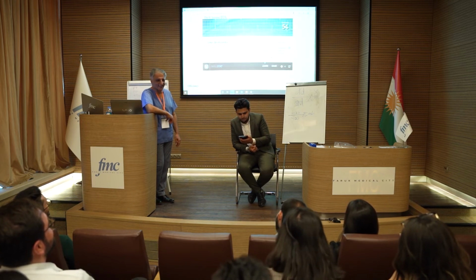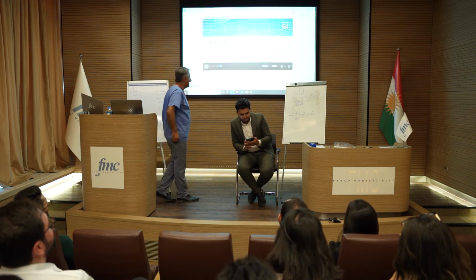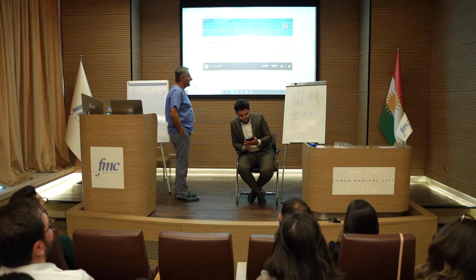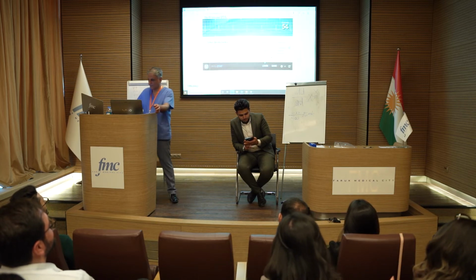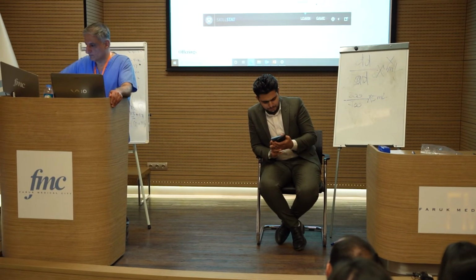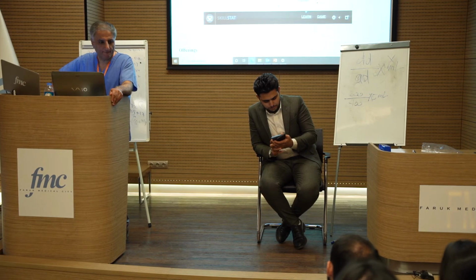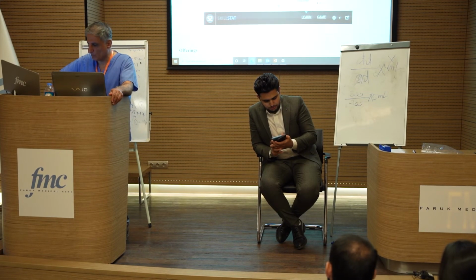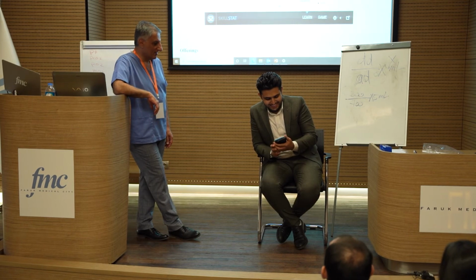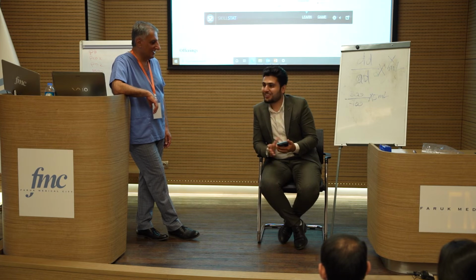Is there any electrical activity? Yes. Okay, what's the ventricular rate? 54. Is it regular or irregular? Regular. Is the width normal, narrow or broad? It's normal. Is atrial activity present? Yes. Associated? Yes. So what's the diagnosis? You tell us. I think I've taken it mistakenly. I thought they would tell me the diagnosis.